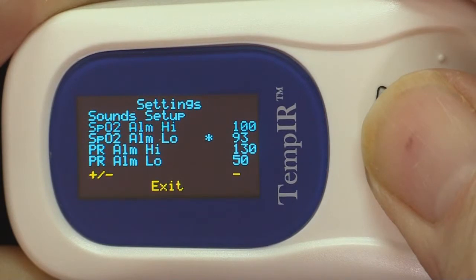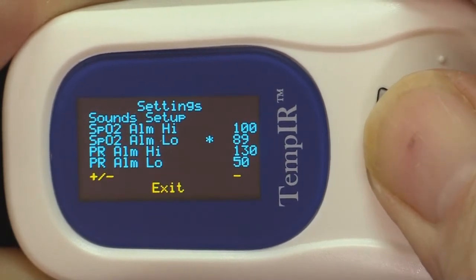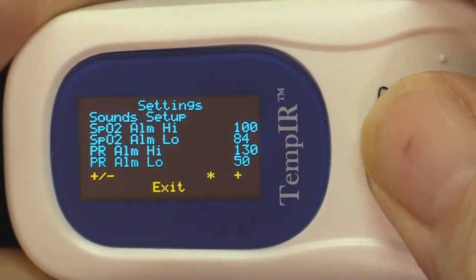In this demonstration we are going to alter the value of the SP02 low alarm. This is done using the longer press, or holding the button down which will cause the value to change automatically. To increase the values, navigate to the plus minus option and select plus with a longer press.